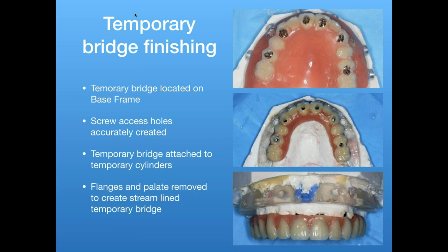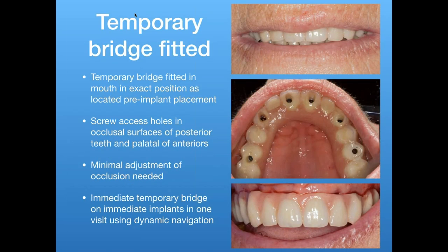So this is now no longer attached to the base frame, but it is now in the exact position that it was in the mouth when we started. So the temporary bridge can then be fitted in the mouth in that exact pre-implant placement position.